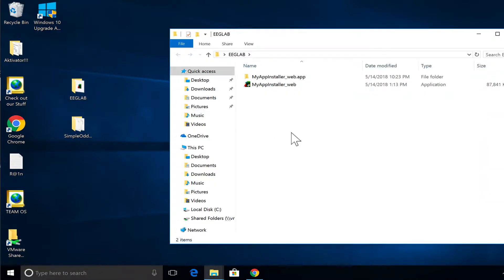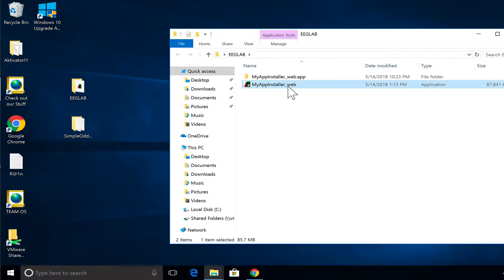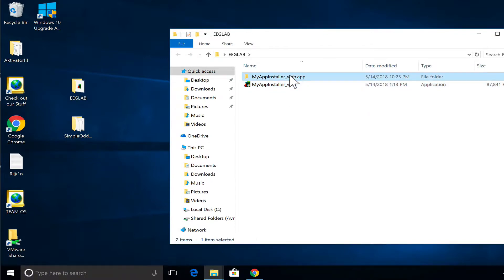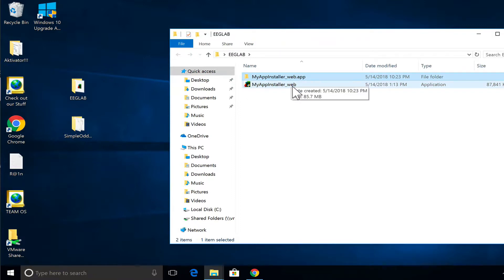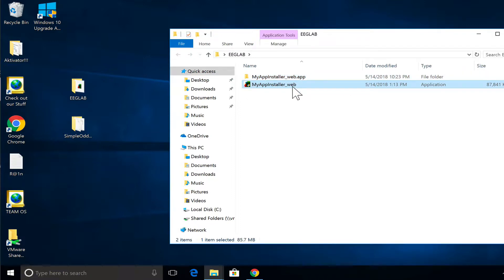Here you double-click and you have two files — either this one or this one. If you're on Windows you click on this one; if you're on Mac you click on this one. You don't have to worry because you can't start the Windows file on Mac or the Mac file on Windows, so whichever works for you is for sure the right one.